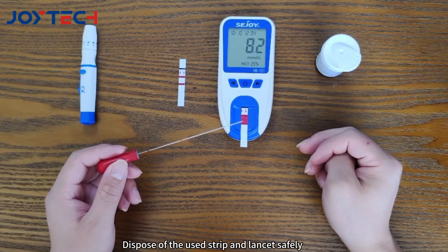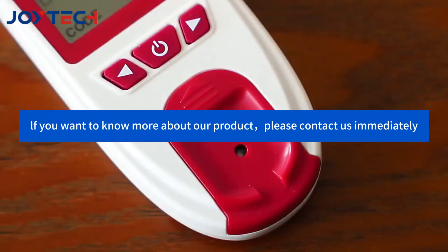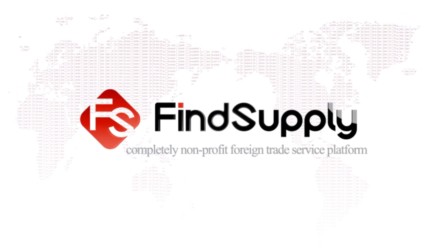Dispose of the used strip and lancet safely. If you want to know more about our product, please contact us immediately. Find Supply — a completely non-profit foreign trade service platform.